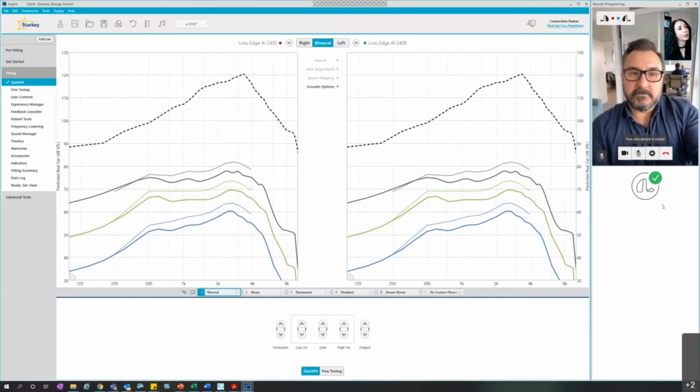How's that sound for you now? Does it sound a little bit better, a little more comfortable? Yeah, it definitely does sound a little bit softer, which is nice. Perfect. Let's address those issues with your restaurant memory.